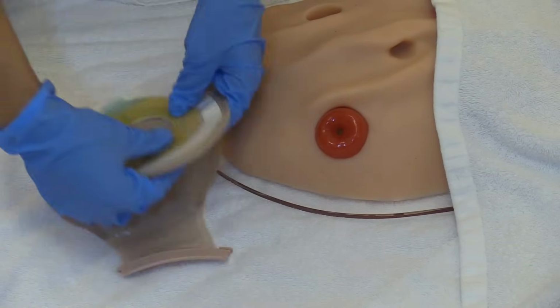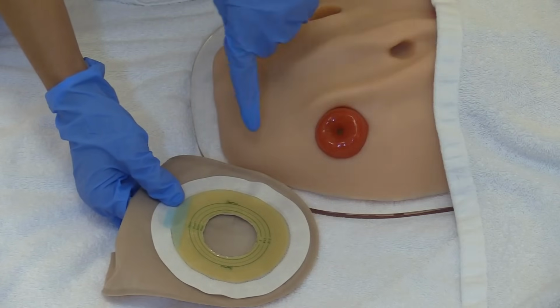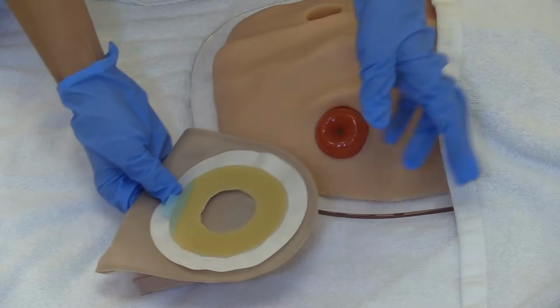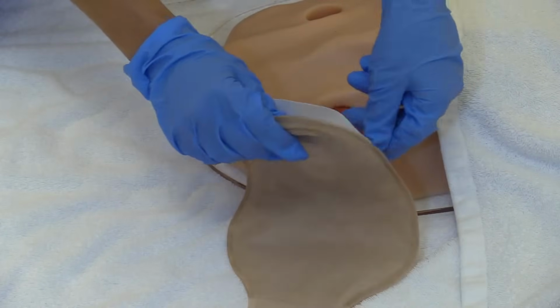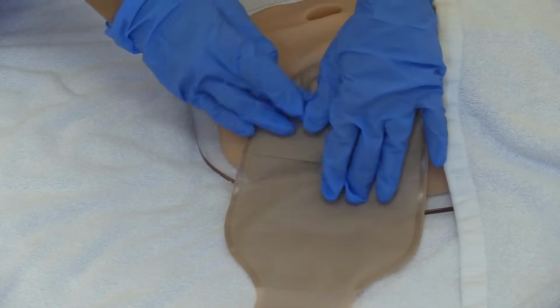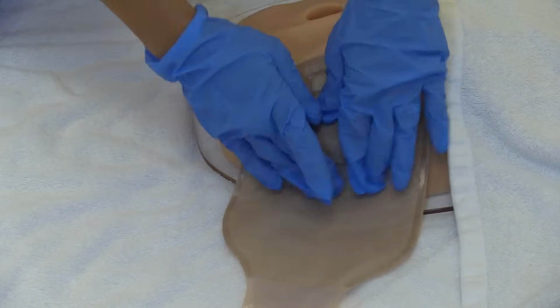And then you will take the backing off of your skin barrier. And if you're going to place a barrier ring, now would be the time to do that. So you place the barrier ring on around the stoma, and then you would place your skin barrier, your wafer flange, on over the stoma. And you want to make sure that it fits really good and that you smooth it around the stoma so it's sticking to the skin appropriately. And feels very good.